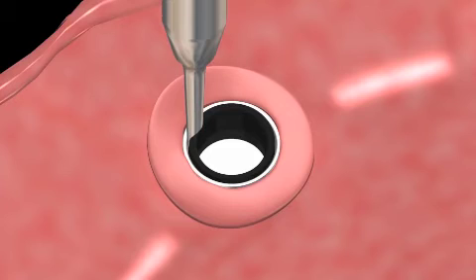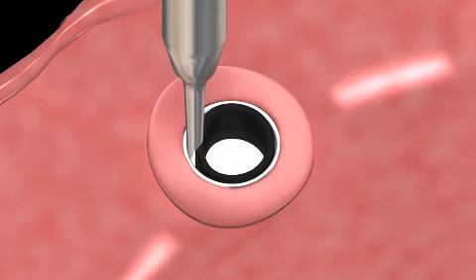Collapse the remaining ring into the open space. The ERA extraction tool is recommended.